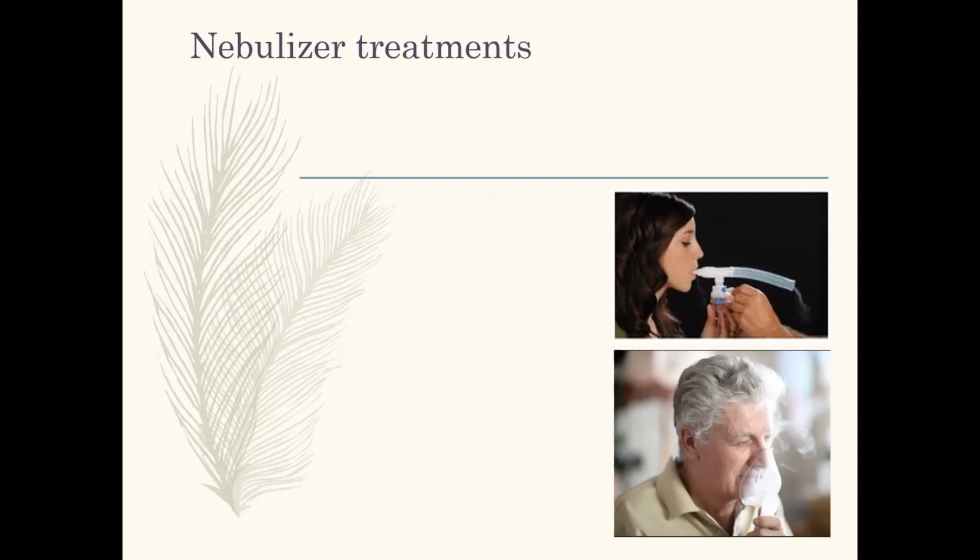If you're inpatient and in the hospital, the medical air is usually between 6 and 10 liters. It just depends on the type of mask and different types of nebulizer that they're using. So you want to follow respiratory therapy's lead on it, or what your order says. What should happen is there should be enough medical air movement to go through where that liquid medication is, and it's going to turn that liquid medication into an aerosolized medication. It's going to make it kind of fog and steam up. That's what we should see. You should see that aerosolized medication.